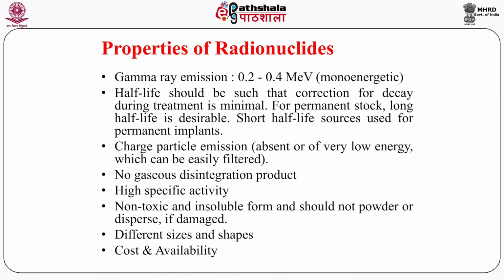Non-toxic and insoluble form, and should not powder or disperse if damaged. The radioactive source should not be toxic, and it should be insoluble in form, not in powder form. If it is damaged, then if it is in powder form, this powder will come out and spread in the vicinity, and there will be radioactive contamination in that area. So such type of sources should not be used in brachytherapy.